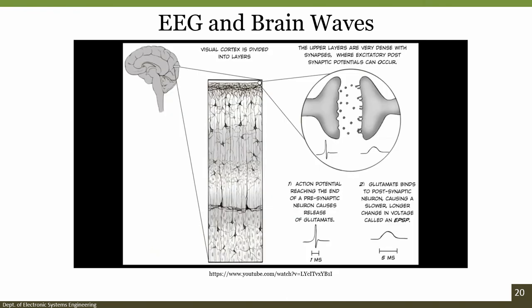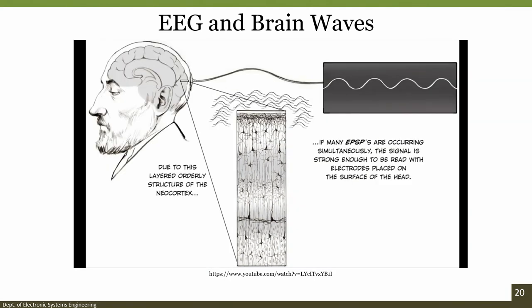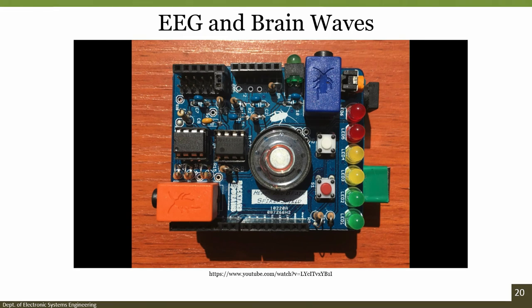The physiological underpinnings of the EEG signal are complex and still a topic of active investigation in the neuroscience community, but we currently understand it to be the summed activity of many synapses in the upper layers of the cerebral cortex. Our Heart and Brain shield thus amplifies the electrical activity of these synapses such that we can view them on a computer under the appropriate conditions.